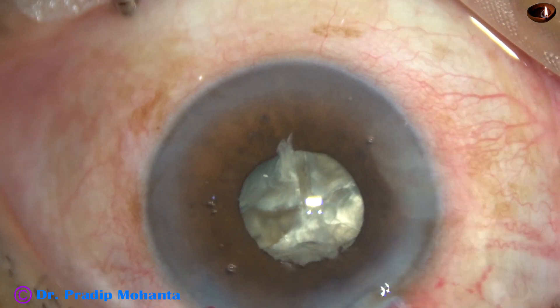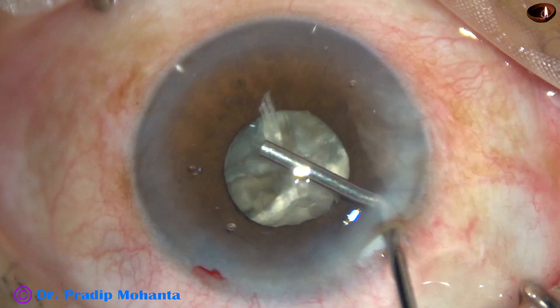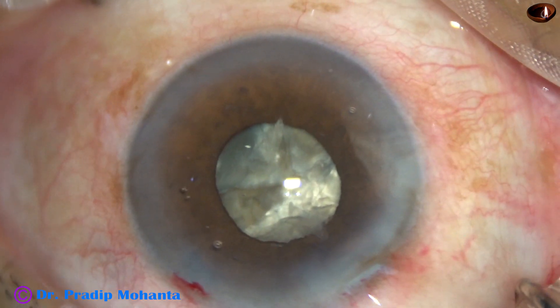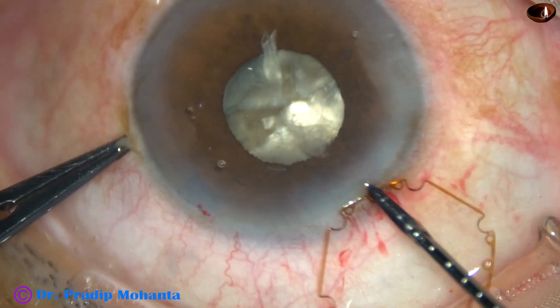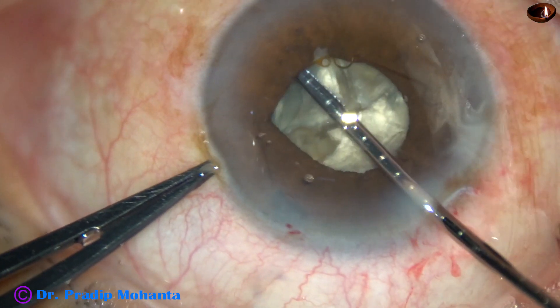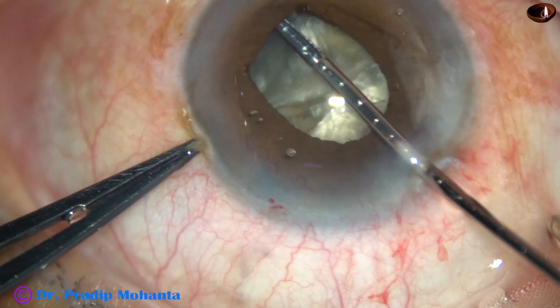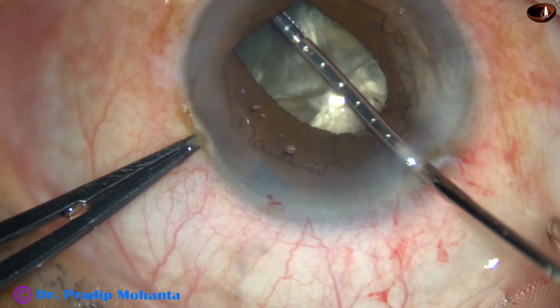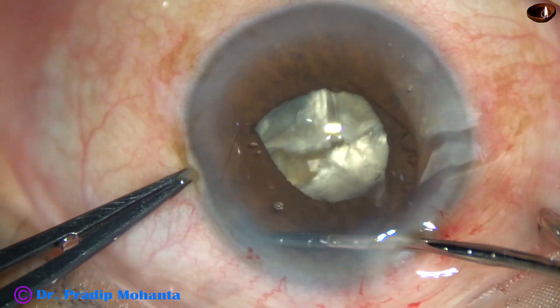Friends, if the pupil constricts during surgery of a hard cataract, it is always safer to use a pupil expansion device. The pupil expansion device is this — this is B-hex, Bhattacharji hexagonal. It is a beautiful device invented by Dr. Subhan Bhattacharji of Kolkata.